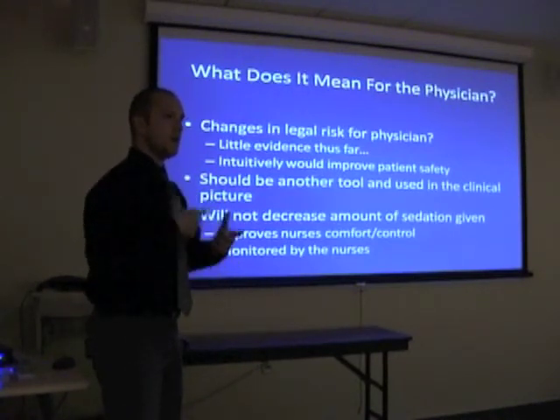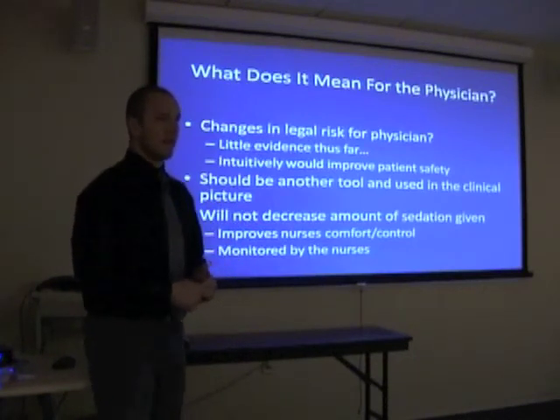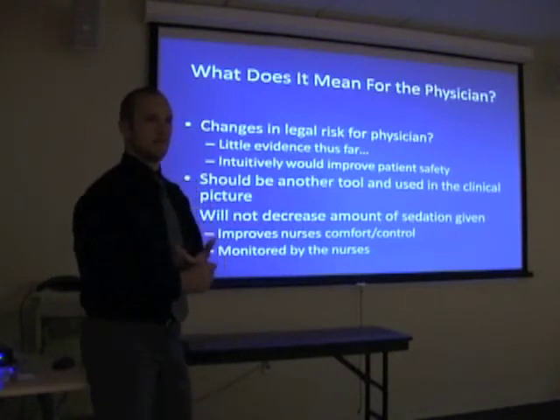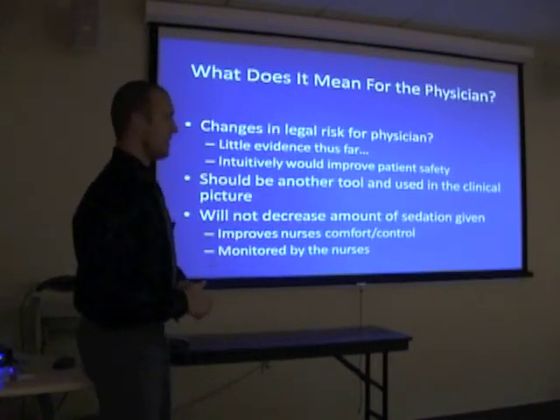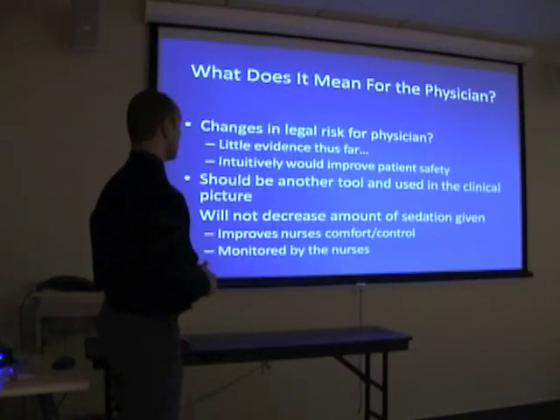Because it's such a new change, we just rolled this out, and a lot of hospitals weren't doing it before. It's going to take a while for the data to come out to see, one, if it improves patient outcome. I think that's one of the biggest things for us. And two, does it change the medical legal risk for the endoscopist or whoever's using the moderate sedation? So I think those are going to be really important things coming down the pipeline, hopefully in the next year or two, to determine if this is useful.